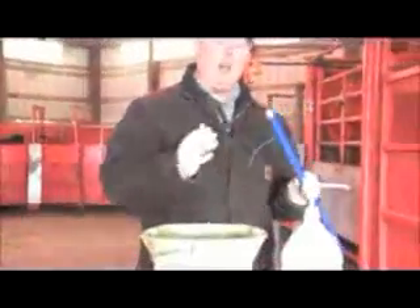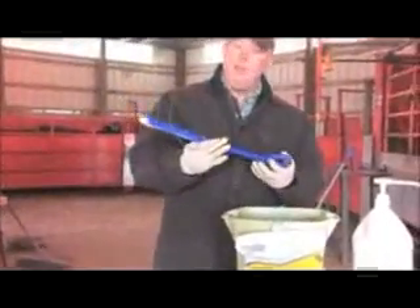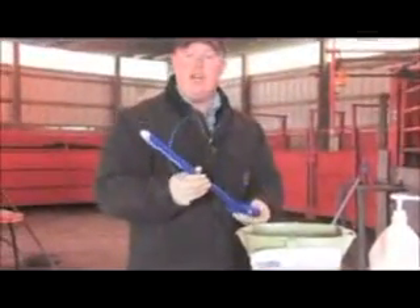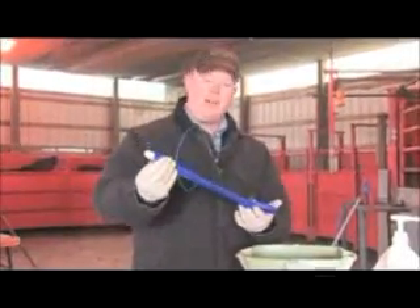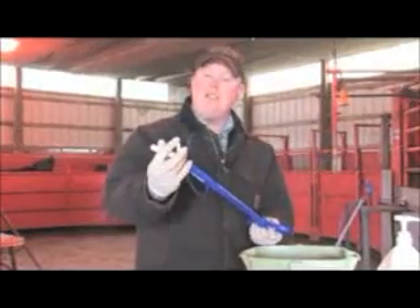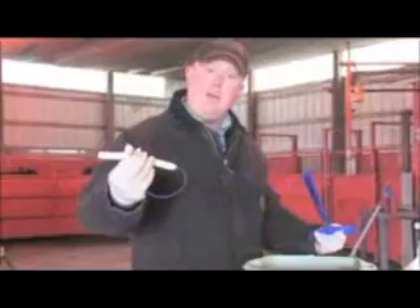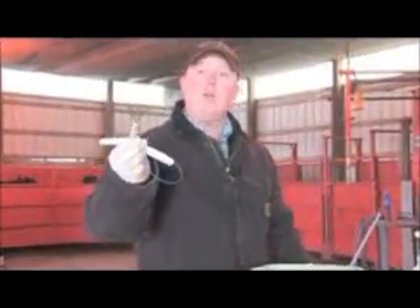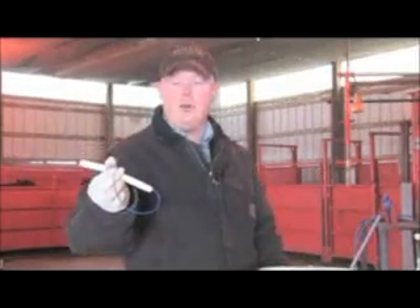Further press the CIDR into the application gun, trying to ensure that the wings come together at the end to minimize discomfort to the cow when inserting the CIDR. Next, before inserting the CIDR into the cow, add ample lubrication to the CIDR and the CIDR gun. The way the CIDR works and stays in the cow is you insert it into the vagina at a slight upward angle. Once in place, depress the handle of the CIDR applicator, allowing the wings of the CIDR to expand, holding it in the vagina. Then remove the applicator.